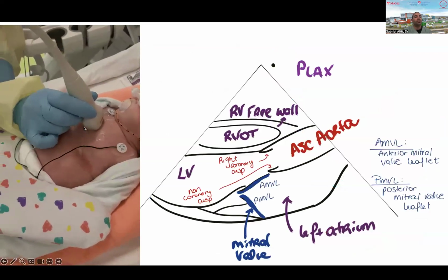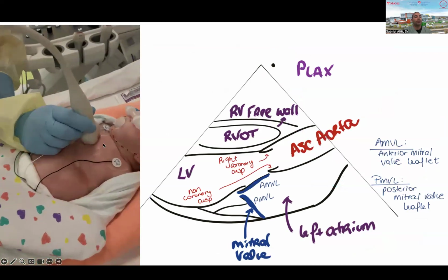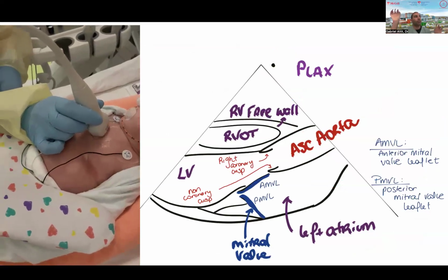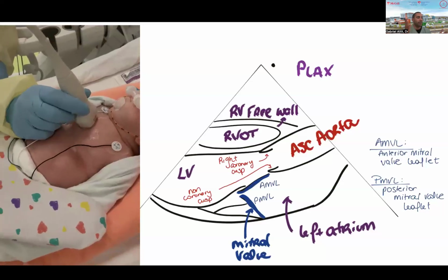So here you see this is Chiran doing the parasternal long axis. Typically, in most babies, you'll be around the sternum in the exact area where you would listen for the A or P kind of focus, although we know that in babies, that's not true. It's not the A and the P.